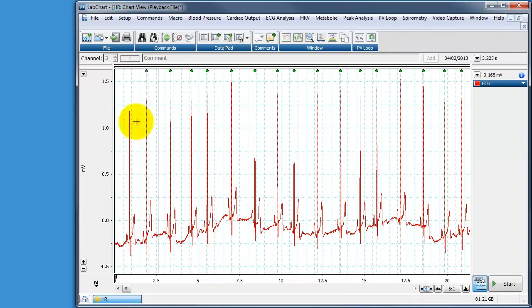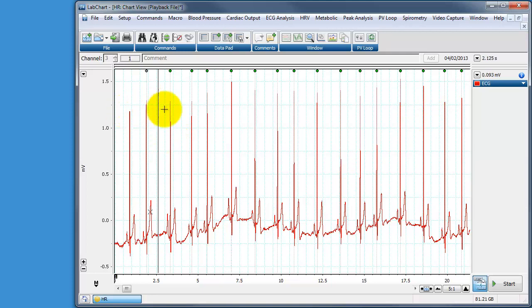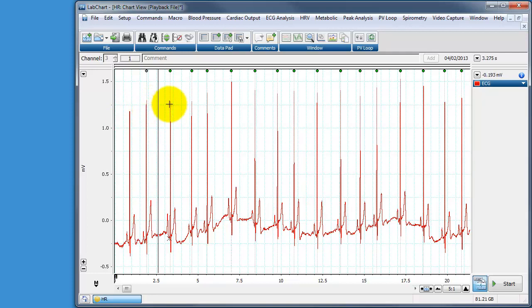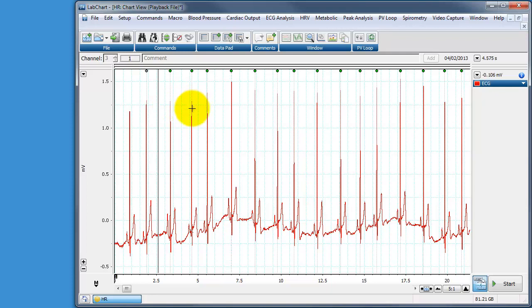So what I'm going to do is first of all look at the data objectively and try and work out what it is that I'm actually asking. What I want to do is I want to look at the peaks of the R waves, I want the computer to select the data, the time between one peak and the other peak, I then want it to add that time to a spreadsheet to the data pad, I then want it to go to the next peak and do this until it reaches the end of the file.